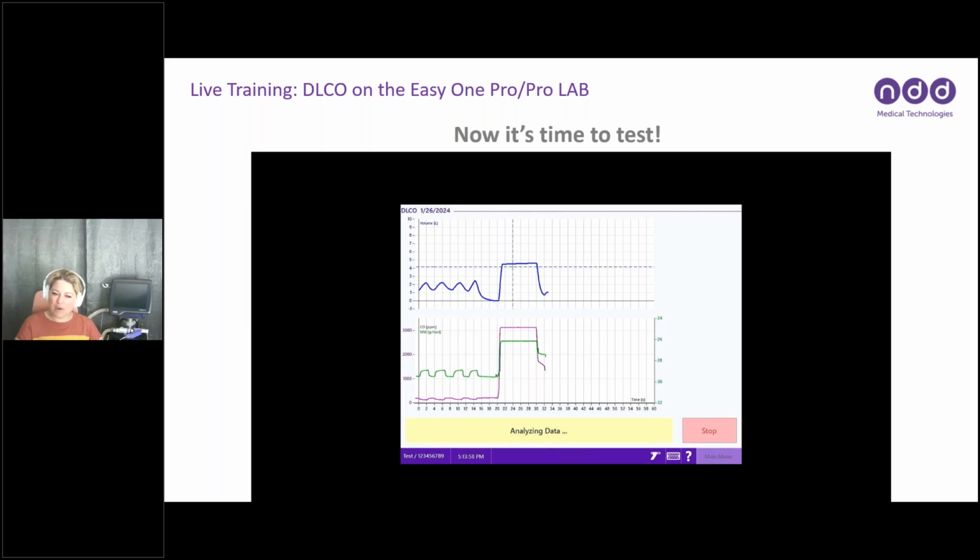All right, we'll let it flip over to the results screen here and talk through a few things in the test.